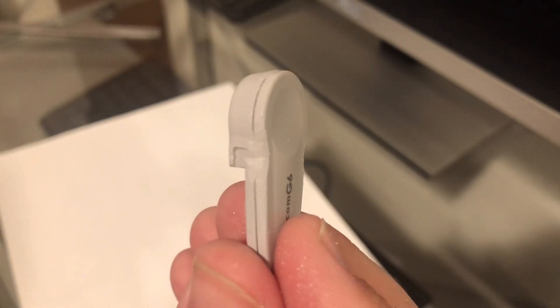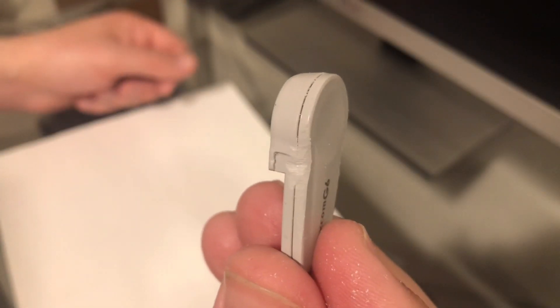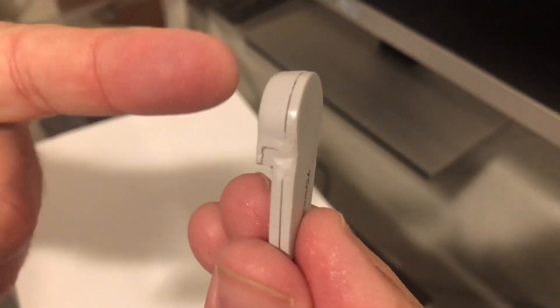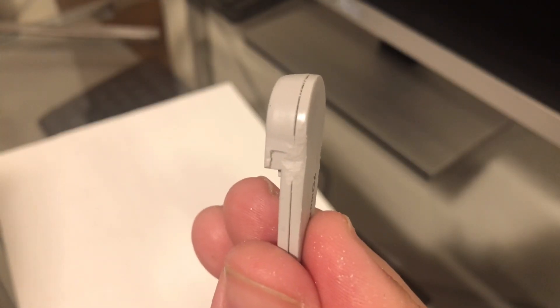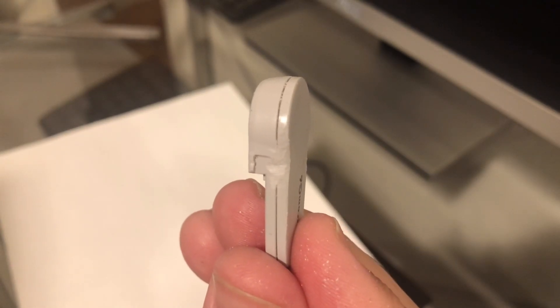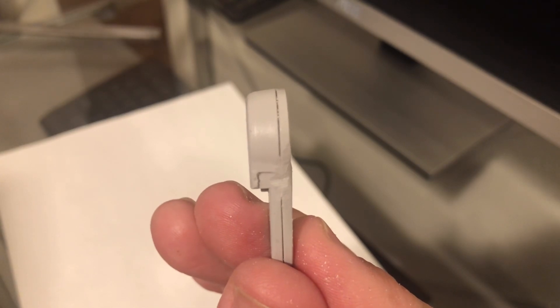Now you'll insert this as usual and start your session. At the end of the 10 days, once it expires, use a toothpick, credit card, or something smooth and slender to poke into the side and release those clips. Remove the transmitter from the sensor, set a timer on your phone for 15 minutes, and once the 15 minutes expires put it back into the same sensor, restart it using the code, and everything should work fine.